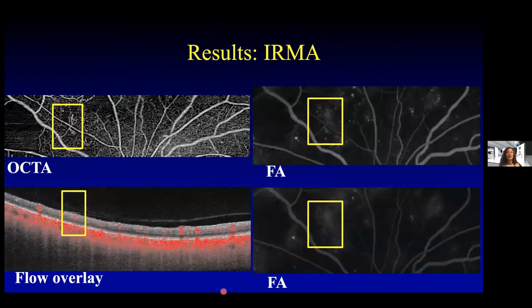Here's another example where an abnormal blood vessel was identified on OCT-A. On the corresponding structural OCT with flow overlay, this area did not extend through the ILM — it's intraretinal flow. Interestingly, on the fluorescein angiogram this area does have a little bit of late leakage.